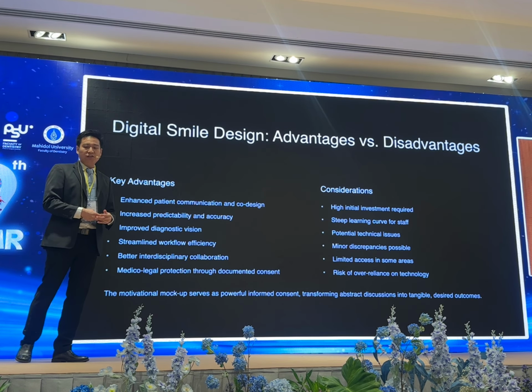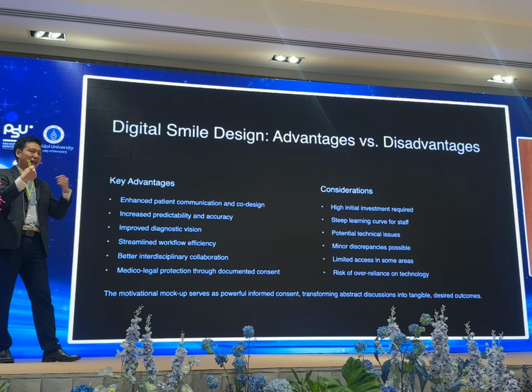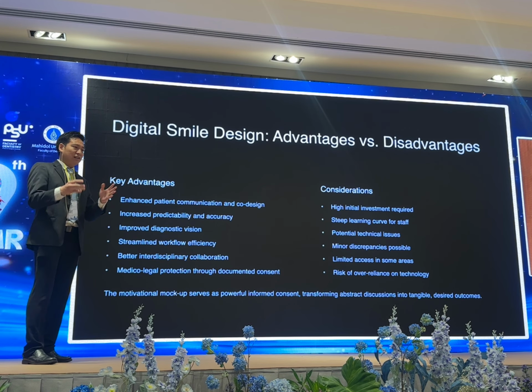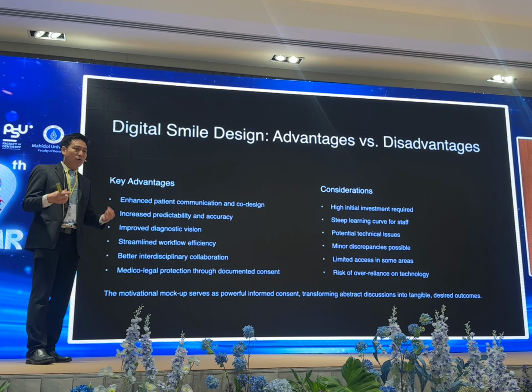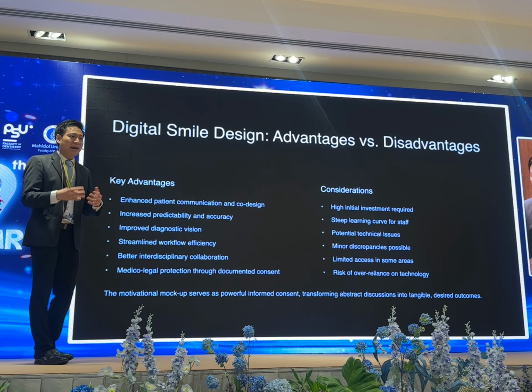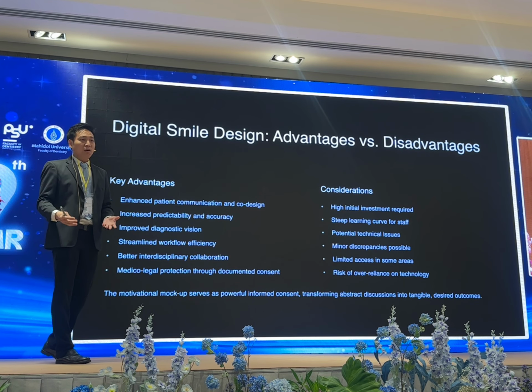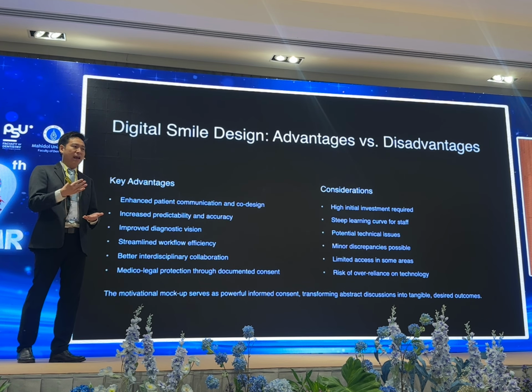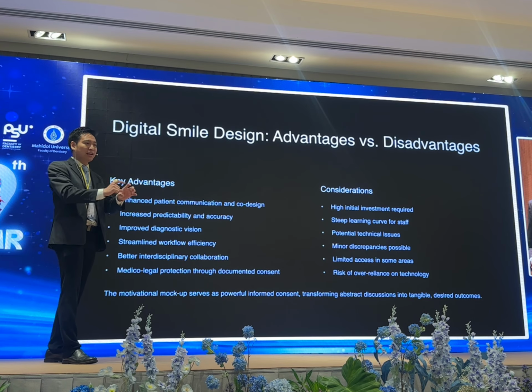The advantage of digital smile design is that it enables patient communication. Patients see together. If you have enough time to sit together and show the patient, this is what I think may look good for you. However, what we think is good for the patient might not suit the patient's personality, might not be perfect for what he or she wants to achieve. With this software, we sit together, we can talk, we can communicate, and we can adjust, we can alter, and we can also tailor-make it case by case. It doesn't need to be something popped out from the catalog.